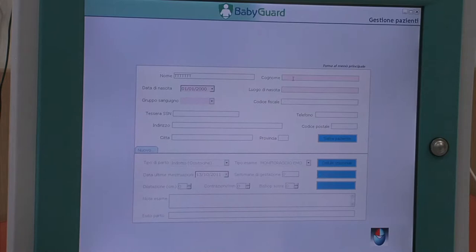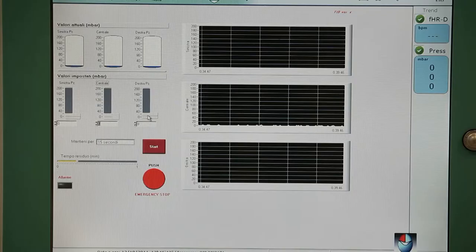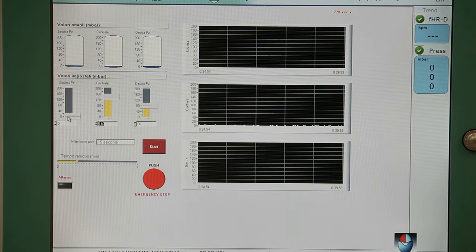La data di nascita ed infine il tipo di esame da effettuare. Si impostano facilmente le pressioni delle tre sezioni della fascia e il tempo.